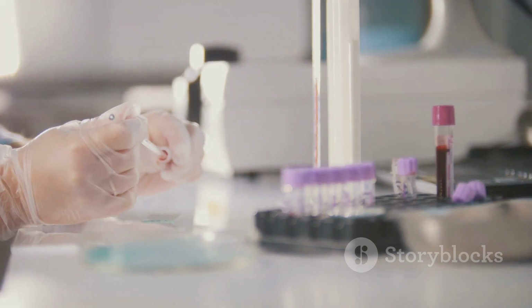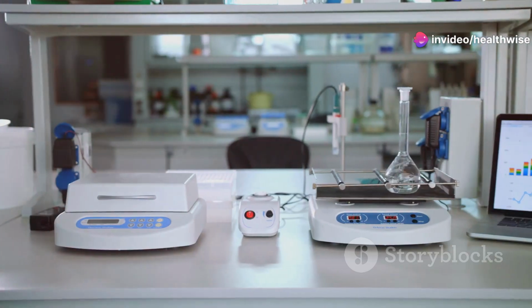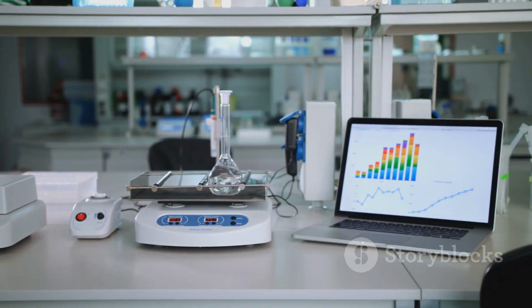Finally, remember that some procedures require a fresh calibration curve with each run of tests. In other cases, you can periodically check the curve by running controls. Always check or prepare a new calibration curve if you change pipettes, reagents, standards, instruments, or technicians.